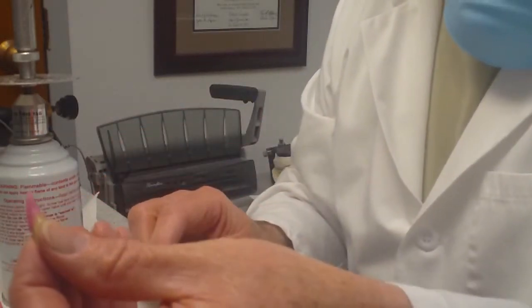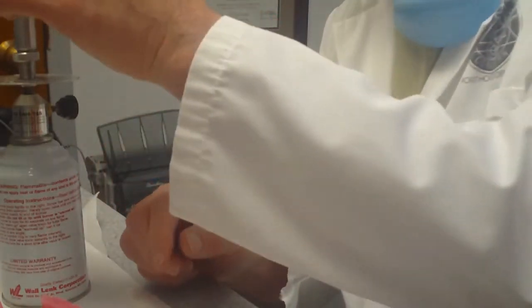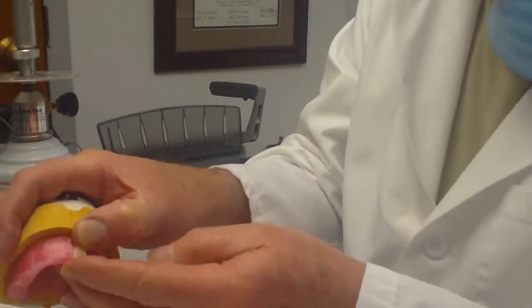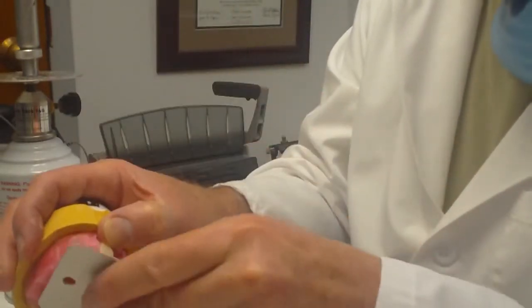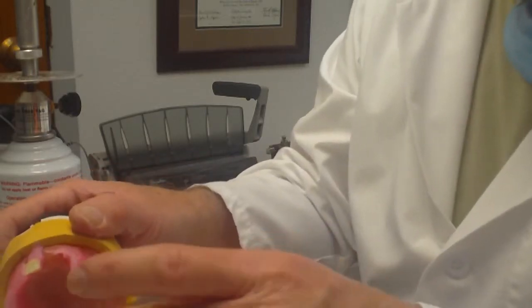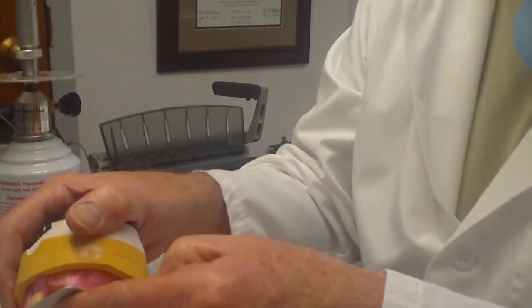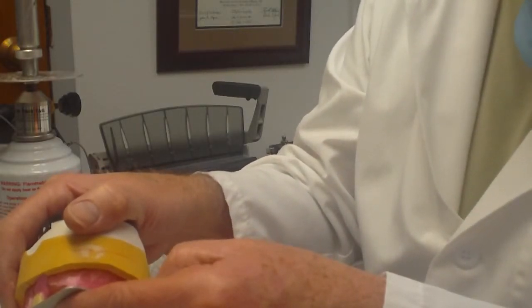Here you can see the little wax root that I've stuck on the tooth, and this gives me a lot of latitude as far as positioning the central incisor. So I'm placing the central incisor, and if you notice I'm trying to get the incisal length correct, and we need to move that down a little bit. So I use this flat plane to help guide me in positioning this tooth, because remember, in the occlusion rim we've established where we want the incisal edge, we've established the length, but we've also established tentatively what we want our posterior, or I should say our occlusal plane to be, anterior posteriorly.